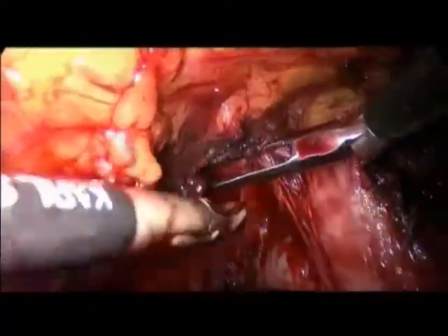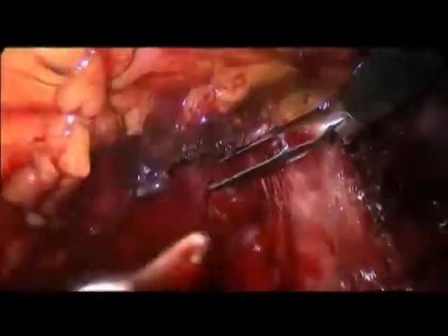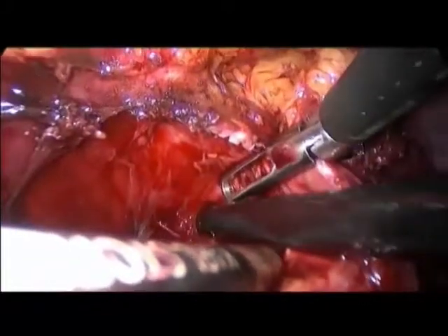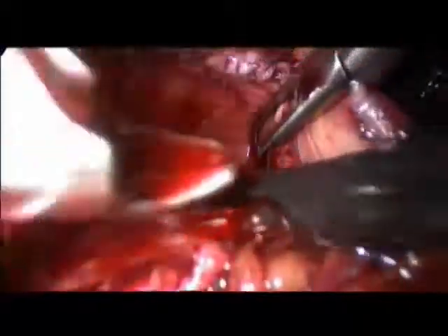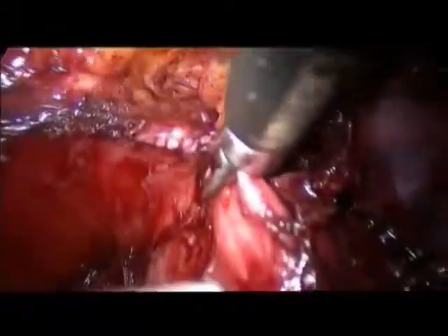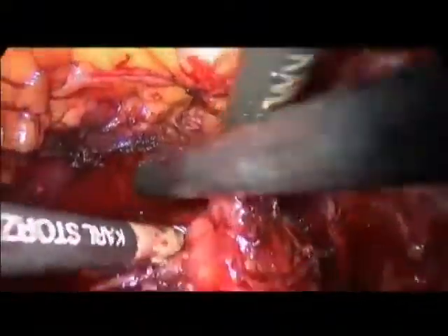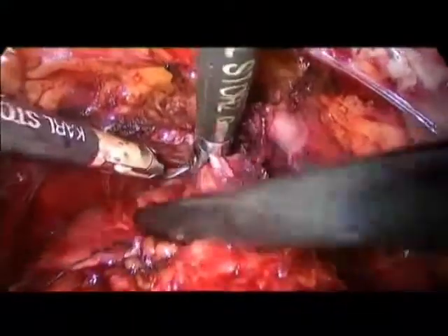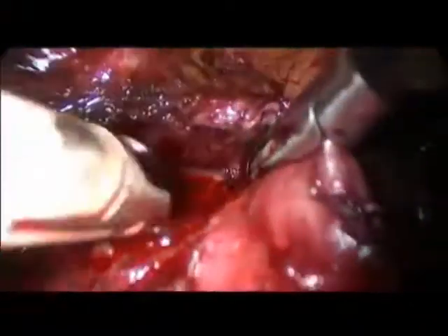We place this forceps, and before closing it, we move ventrally in order to be really in contact with the bone, so that you see the amount of tissue we still have on the prostate side before closing the instrument. And the length of the forceps makes it unable to catch the urethra. Roland, how sure are you that you're not biting into the anterior aspect of the urethra with this huge forceps? Well, I know by experience that we are far enough. The urethra is there behind. And I know that the forceps is too weak at the tip to catch such a structure containing a catheter, which, as a matter of fact, is filled.